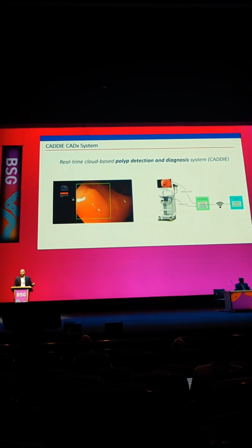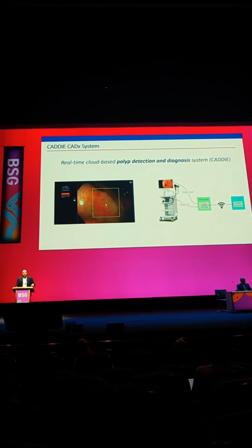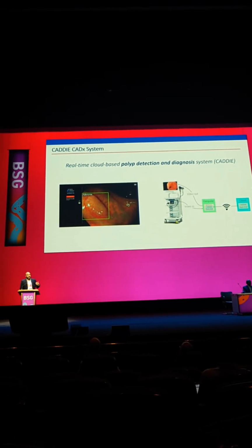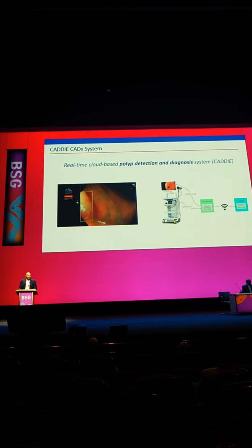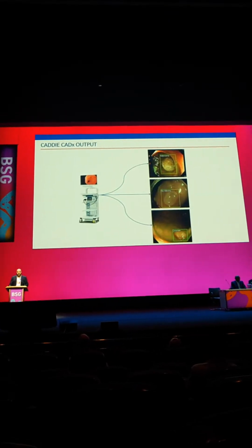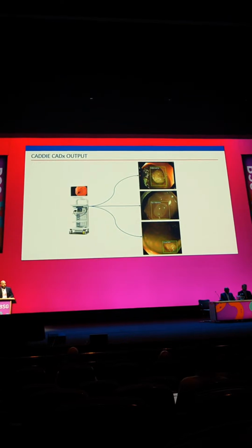So as the front end user, the endoscopist, you're using the latest piece of kit at all times. Kind of similar, if you like, to how we have apps on our phone or how our phones are regularly updated with a click of a button. That's almost the idea of what we're trying to implement here. But the big question is, does this cloud-based concept actually work in a healthcare system, in this example, the NHS?